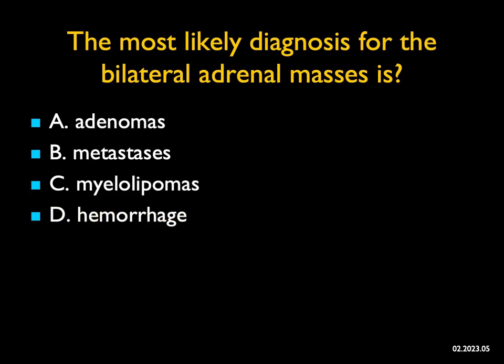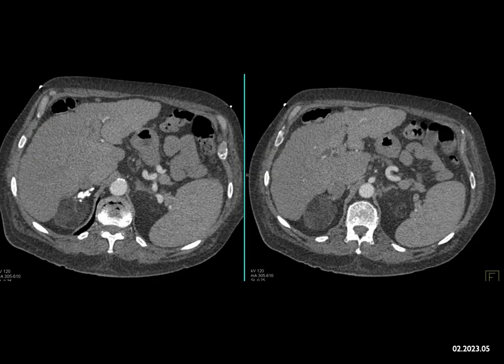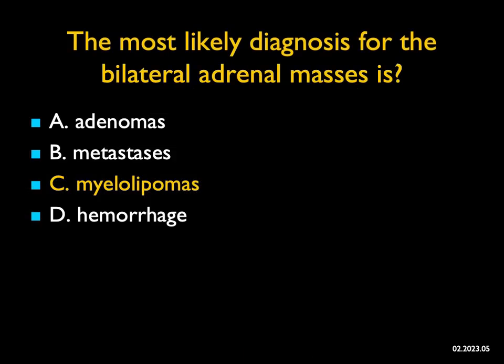The most likely diagnosis for the bilateral adrenal masses in this patient is — you can see there are bilateral masses that have fat attenuation. The one on the right has calcification, but the fat density is key. Adenomas measure up to minus 10 perhaps; this would measure minus 70. Metastases, even from liposarcoma, are not going to be fatty tumors, and hemorrhage is high density. This is a classic example of bilateral adrenal myelolipomas. Myelolipomas are usually unilateral but can be bilateral. They can calcify — more commonly punctate calcifications, but at times the calcifications can be more extensive.